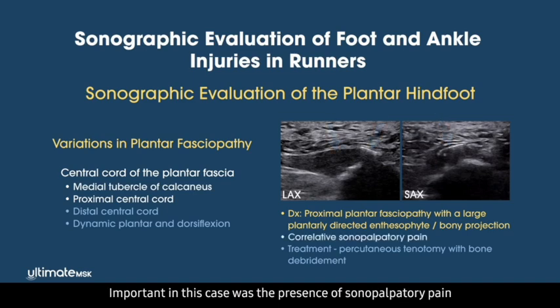Important in this case was the presence of sonopalpatory pain directly corresponding to the enthesiophyte, which has important implications for treatment. Given these findings, an ultrasonic percutaneous tenotomy with enhanced bone debridement capabilities was recommended.